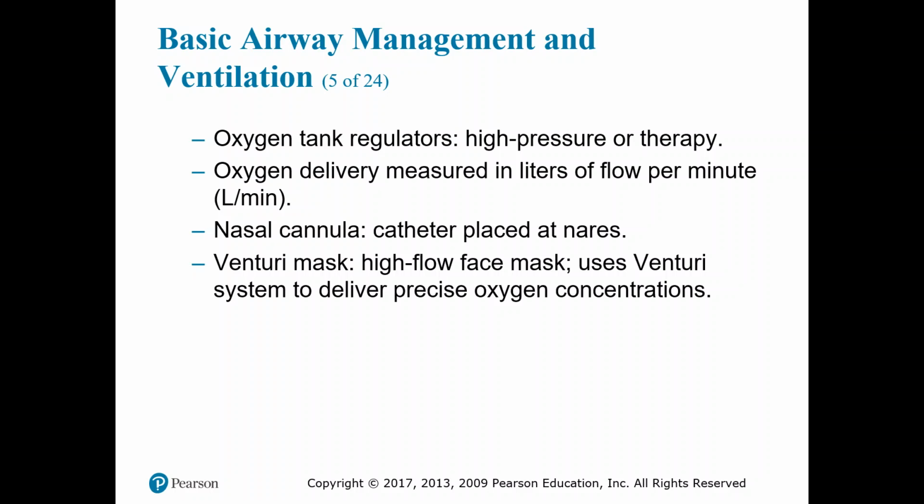But just be aware that it dries out the nares pretty quickly, and they easily break down and develop a bloody nose and such like that, which creates yet another problem. Patients generally tolerate the nasal cannula pretty well, and it's indicated for low to moderate oxygen requirements and long-term oxygen therapy. So these are your COPDers or your CHF, whatever, that they need that supplemental oxygen, but they don't need a lot. So this works pretty well.